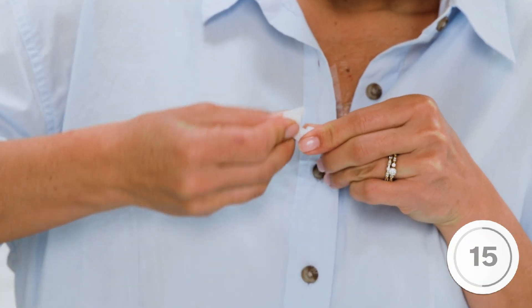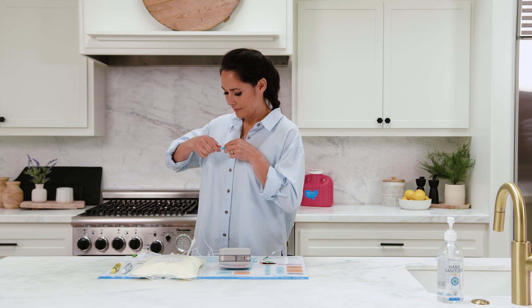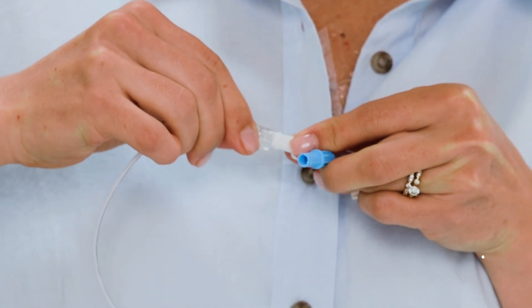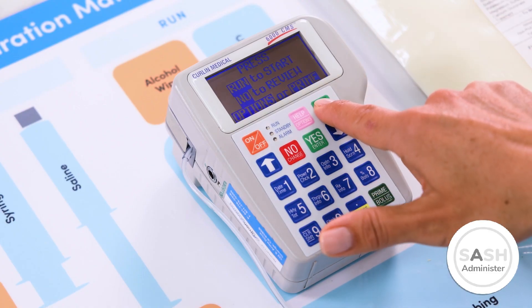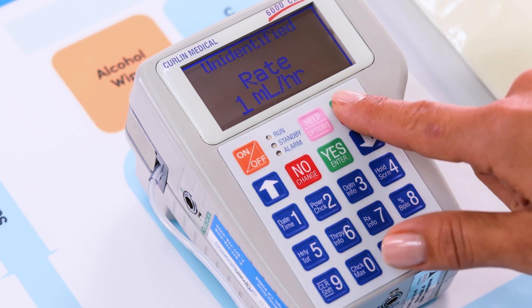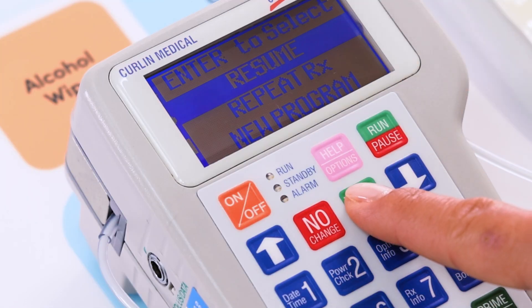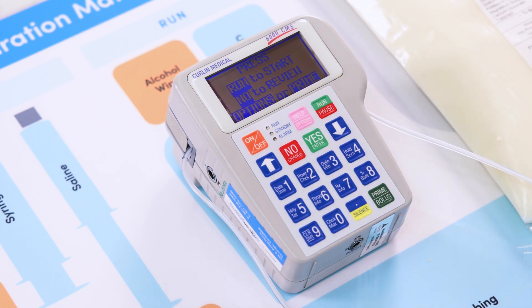Now you are ready to infuse the TPN. Scrub the injection cap of your injection port with an alcohol pad vigorously for 30 seconds and let it air dry for 10 seconds. Remove the cap from your IV tubing and connect it to your injection port using a pushing and twisting motion. Once the tubing is connected to the central line, press the run/pause key. You'll know the process has started when the green light by run starts blinking. If you press pause, a yellow standby indicator will turn on and three options will appear: resume, repeat RX, and new program. Resume is selected by default — press the yes key then run to resume the infusion.